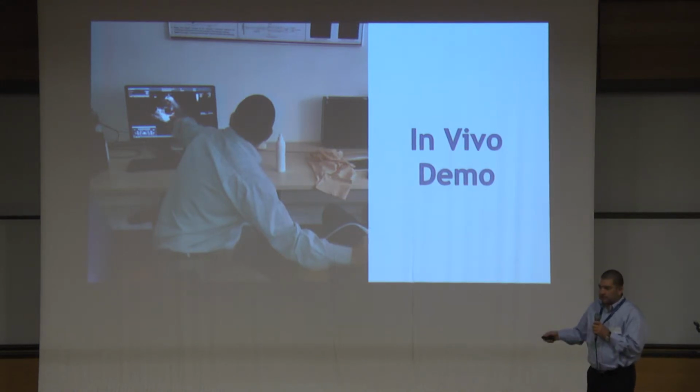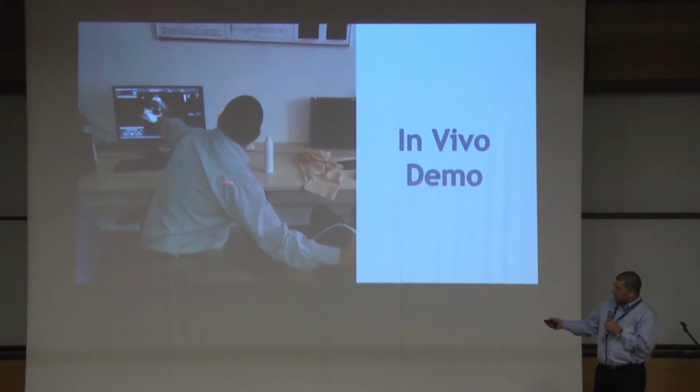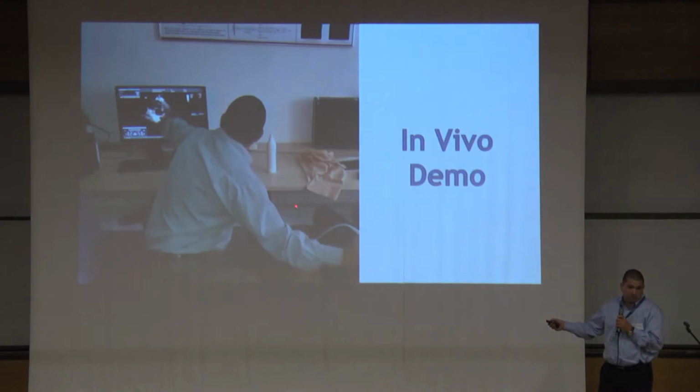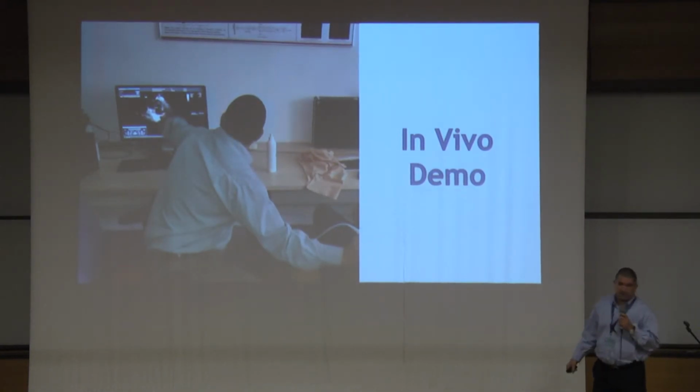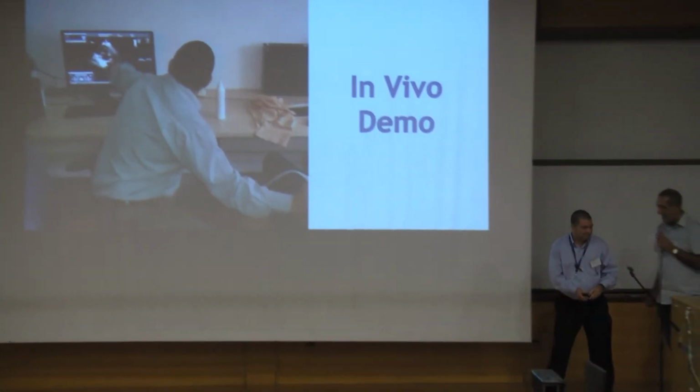So actually, using this exact system, I could do this. I could sample a real person and show all the cardiac structures. And this is what we do actually in everyday use. Thank you very much, Shai.